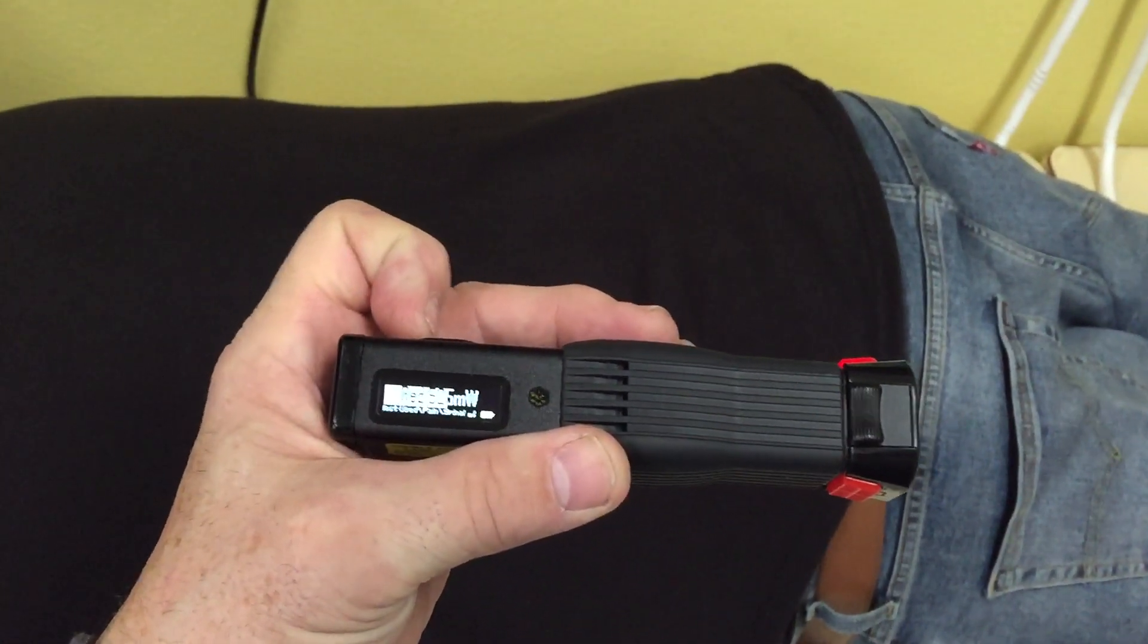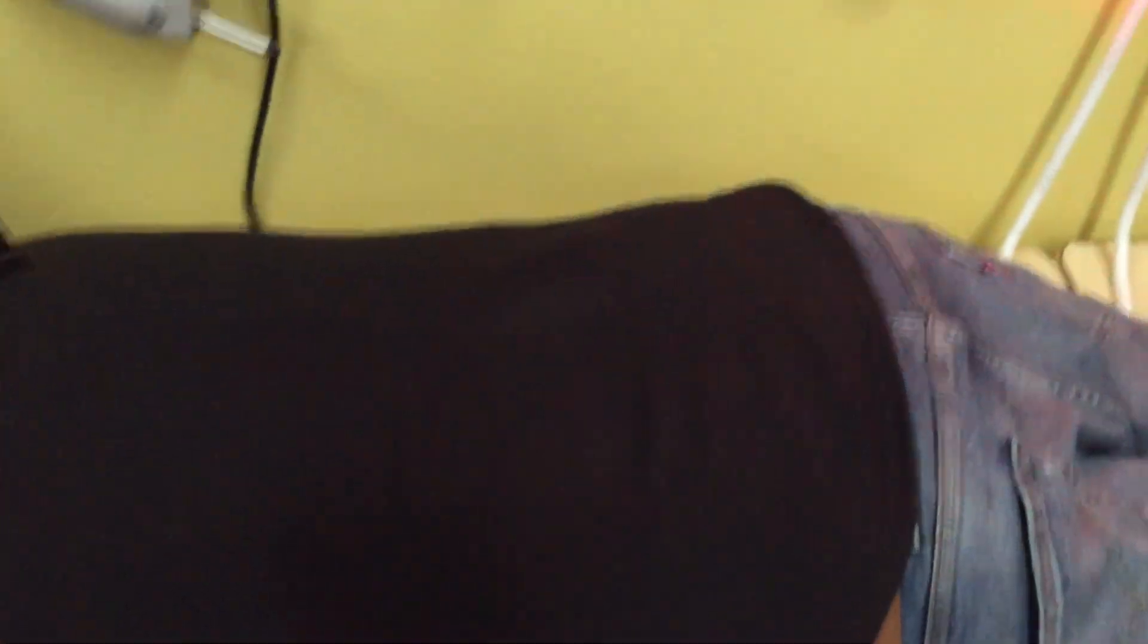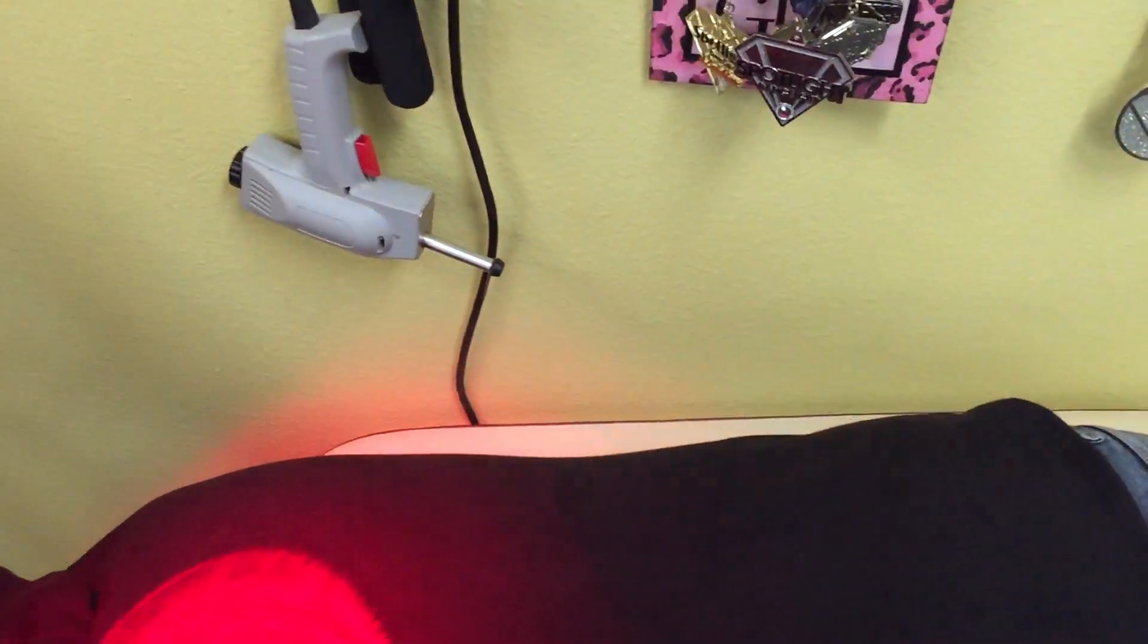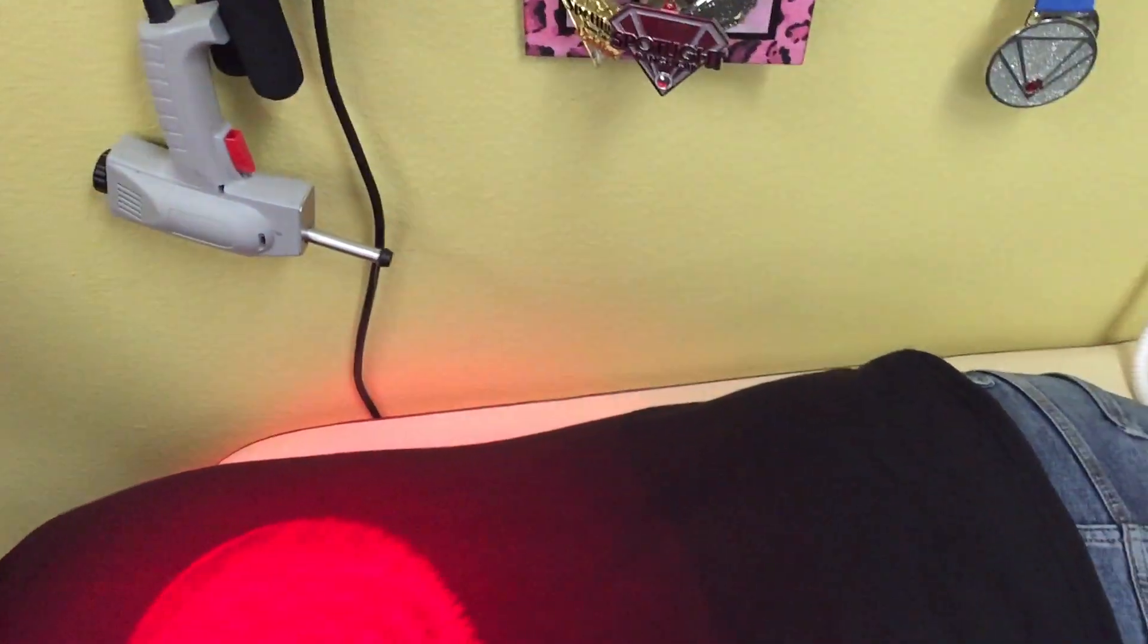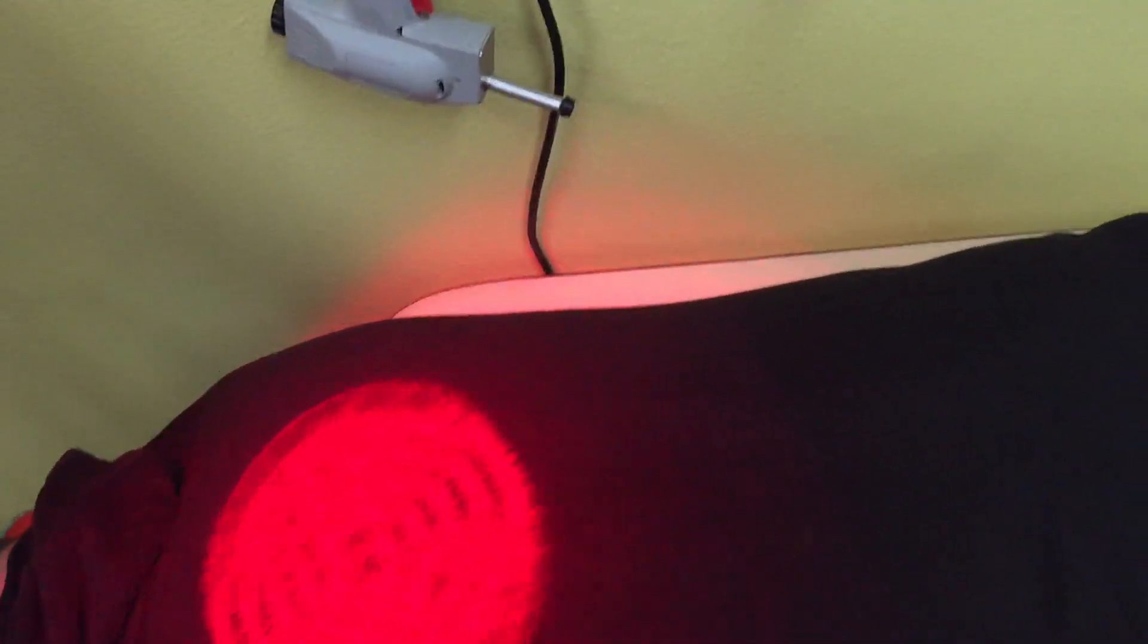We're going to crank it down a little bit as far as power is concerned. And now we're lasering, so this is the lasering technique. This laser is firing at 16 different frequencies, spending about four to five seconds per frequency set.